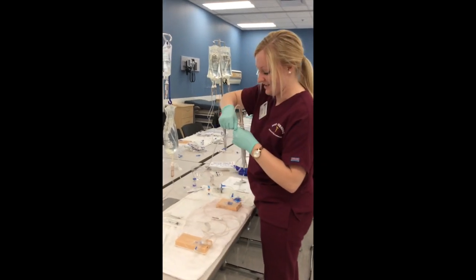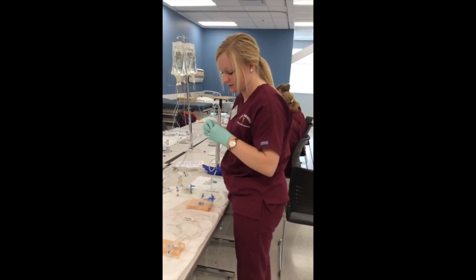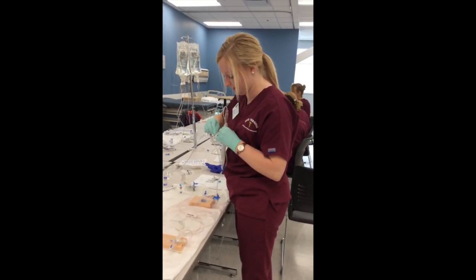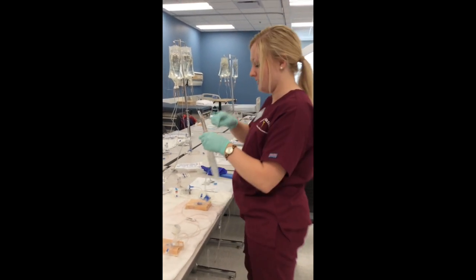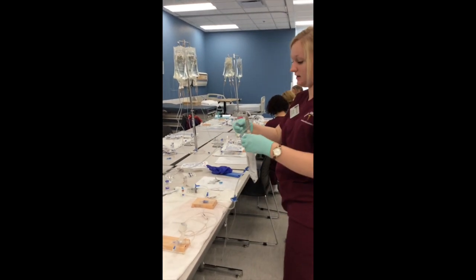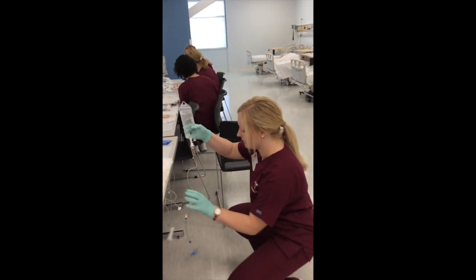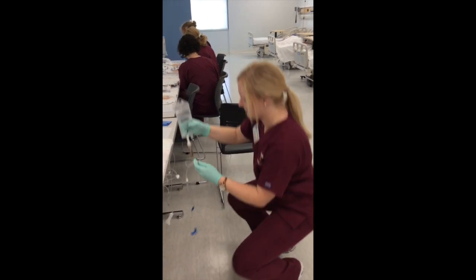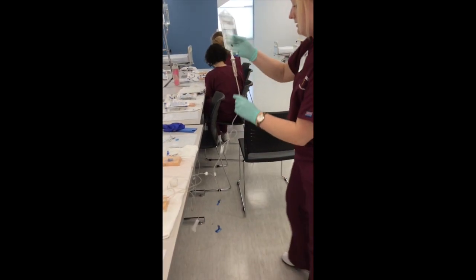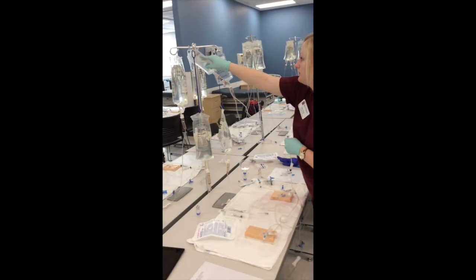Okay, and I'm gonna go ahead and hook this up. And I do have my primary tubing clamped. So now I'm going to take this and unclamp it and drop it below so I can go ahead and prime that tubing. Okay, now that I've done that, I'm going to go ahead and hang it.